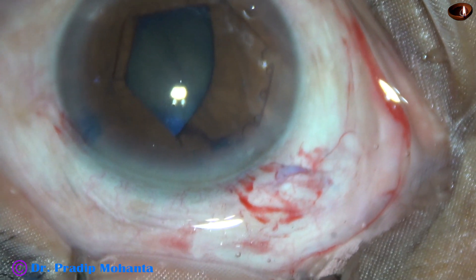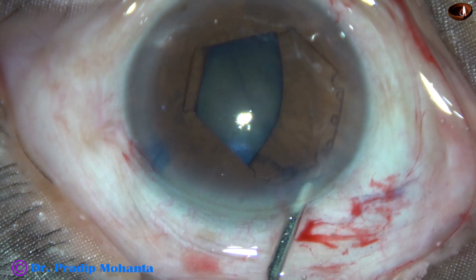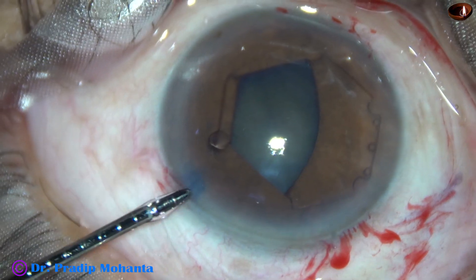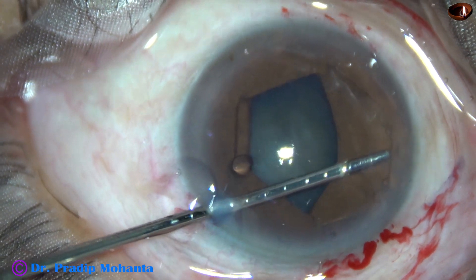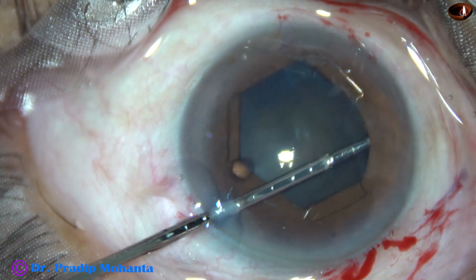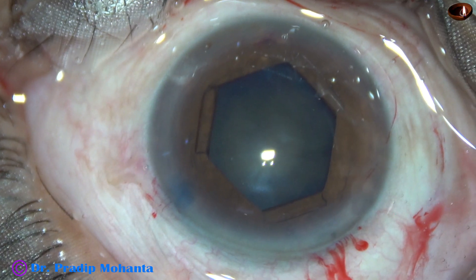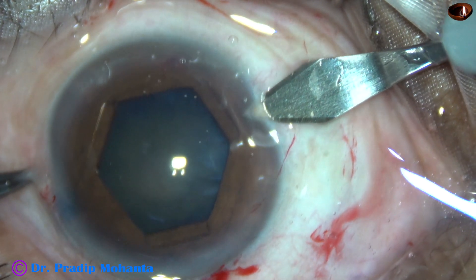Now I go through the left side port. Before that, I injected some viscoelastic because the anterior chamber became shallow. Then I go through the left side port, hold the middle tab of this flange, and tuck this flange under the pupil. Alternate flanges are tucked and the pupil has taken this beautiful hexagonal shape.